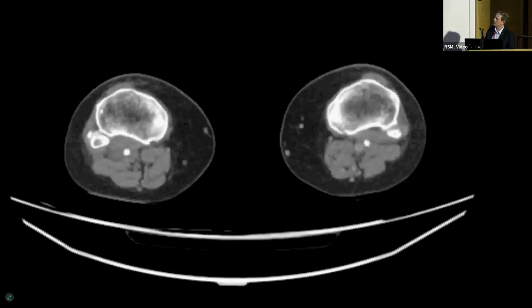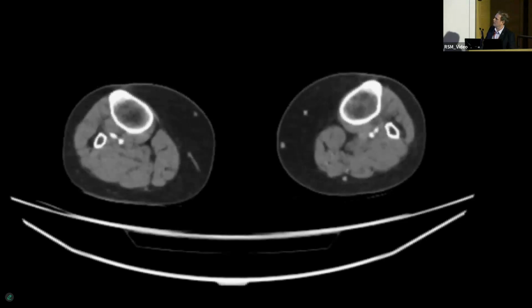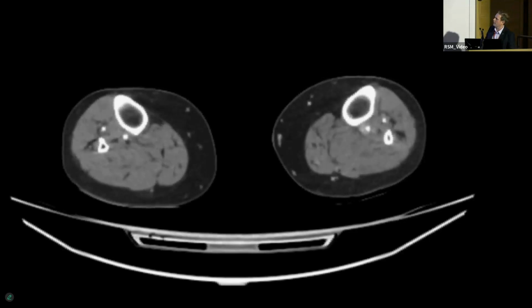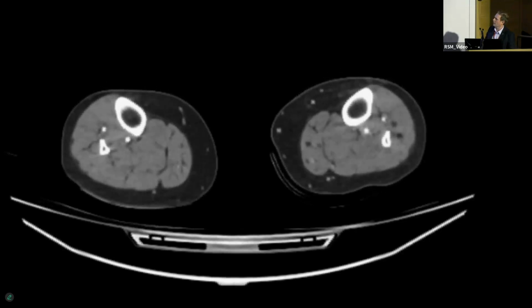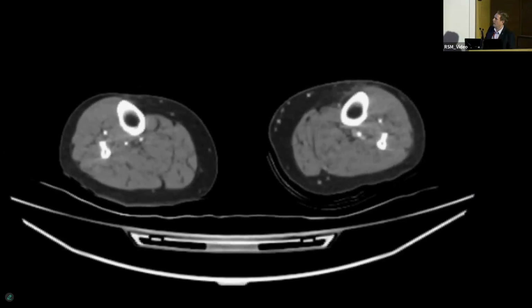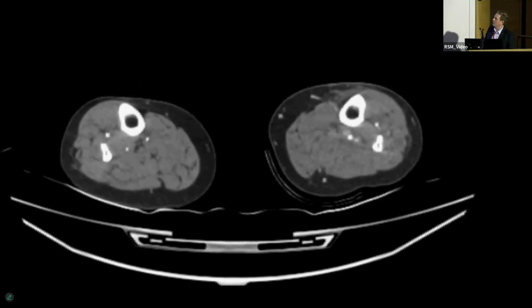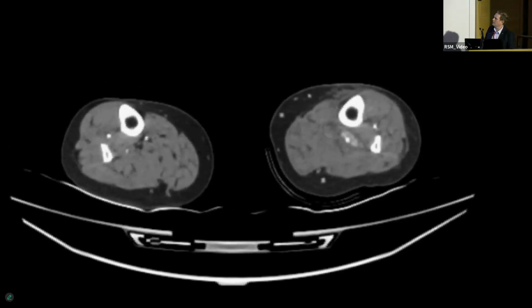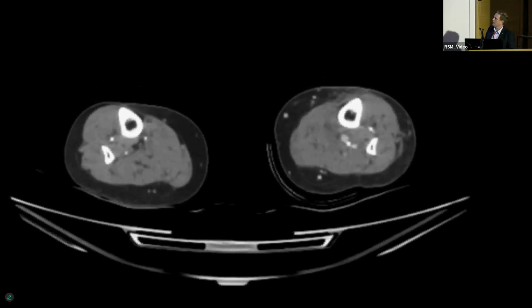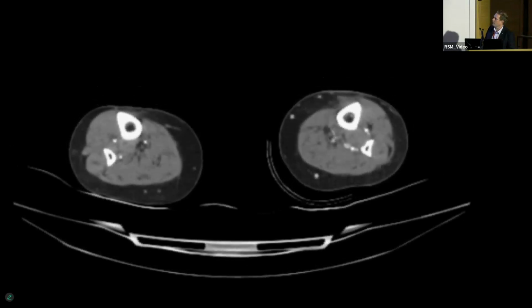And this was the CT angiogram afterwards. What's quite interesting on this one, watch now, you'll see little blushes around it. There's your anterior tibial artery, here's your blush, these are your peroneal artery perforators. These are the blushes because of your perforators to your FHL. There's another blush there. It keeps on going down, and then when it gets to the bottom end, there are more blushes because of the perforators coming to the bottom end, and then it goes down to where the plate is.